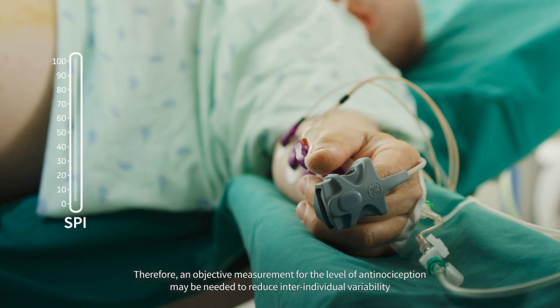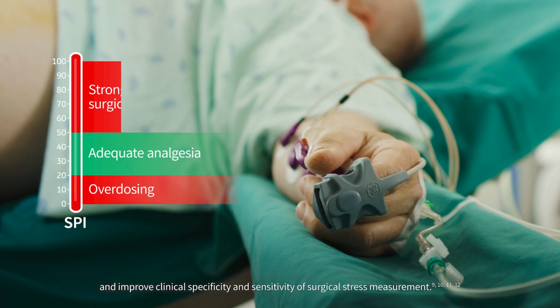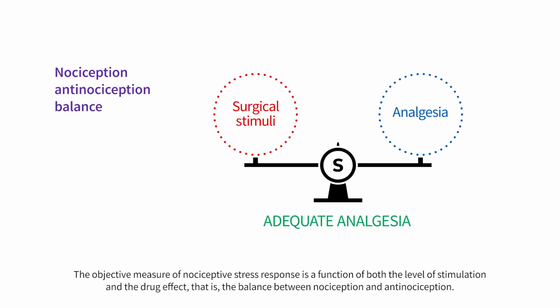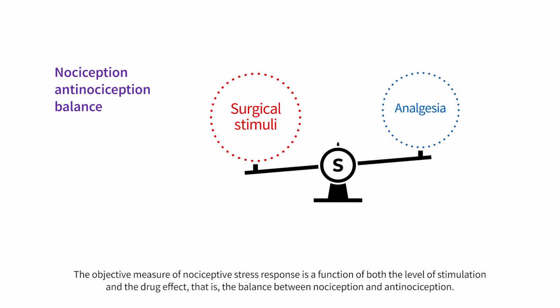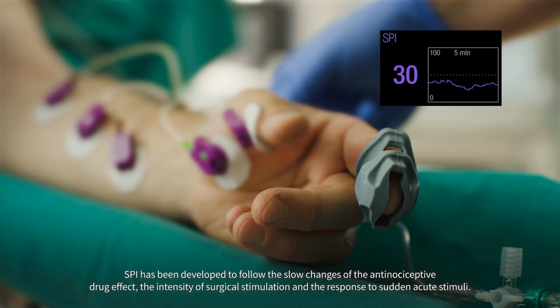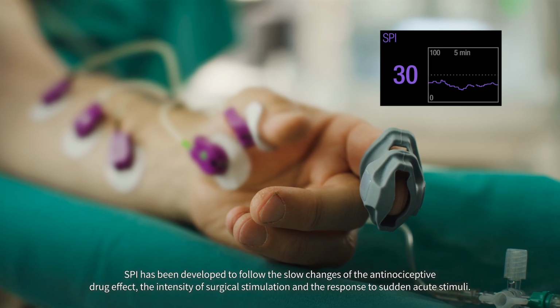Therefore, an objective measurement for the level of antinociception may be needed to reduce inter-individual variability and improve clinical specificity and sensitivity of the surgical stress measurement. The objective measure of nociceptive stress response is a function of both the level of stimulation and the drug effect, that is, the balance between nociception and antinociception. SPI has been developed to follow the slow changes of the antinociceptive drug effect, the intensity of surgical stimulation, and the response to sudden acute stimuli.